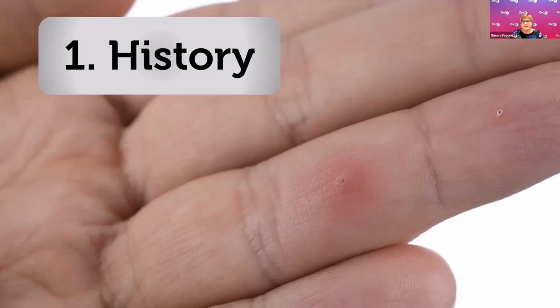past the entry site. It's also handy to ask your patients whether they've attempted to remove it, how many times and when. Recent attempts at removal can sometimes macerate the tissue a little bit and introduce air into the wound, which makes it harder for us to see the foreign body. And the other thing to notice is, how long has it been there? Is there any redness or swelling around the foreign body? Because often we can use this to help us locate the foreign body, and it works to our advantage.